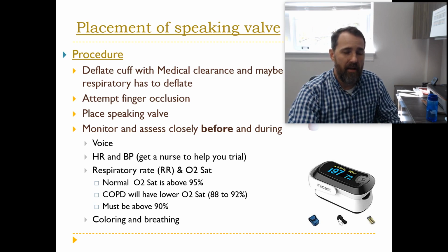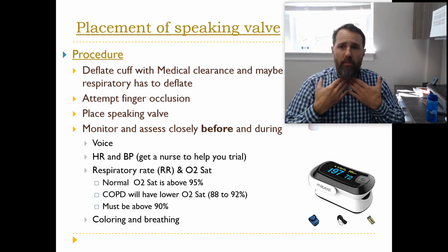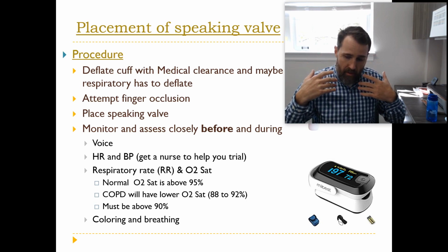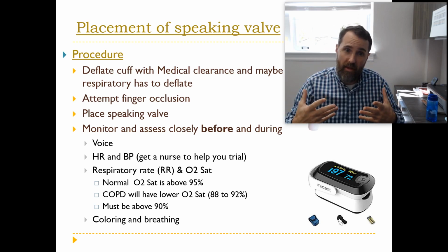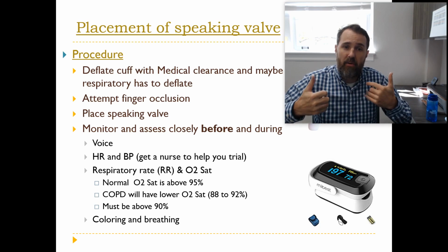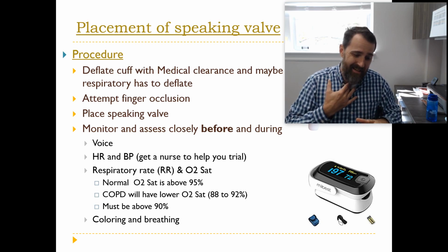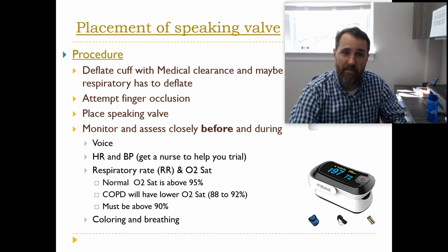It's not a sudden process that you put the speaking valve on and the patient is able to suddenly tolerate it. Usually you place the speaking valve, air is rushing up on expiration through their larynx, their pharynx, the oral and nasal cavities, and this is a sensation that they've been without for some period of time. And also, sensation is suddenly going to start to increase, which means that they're going to want to cough probably. So they're going to be fighting that reflex to want to cough. So there's a lot happening when you place the speaking valve for the first time. So they have to reacclimate to that.